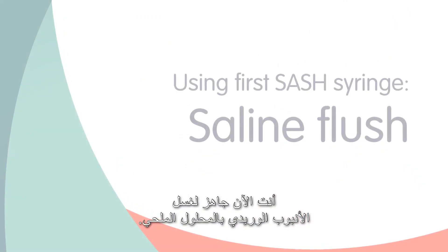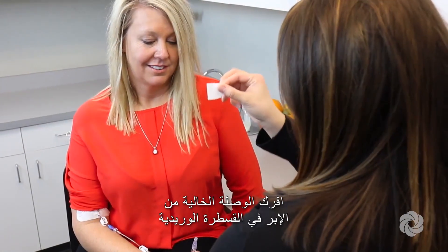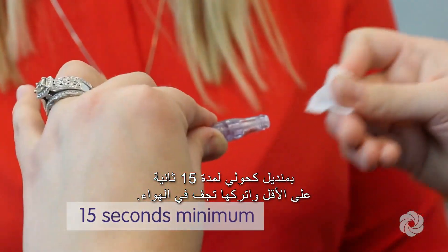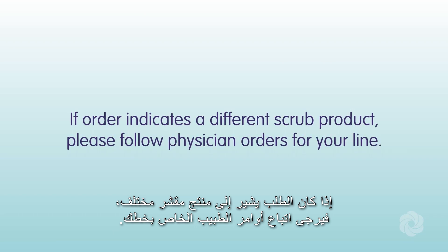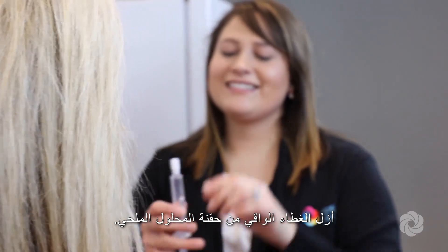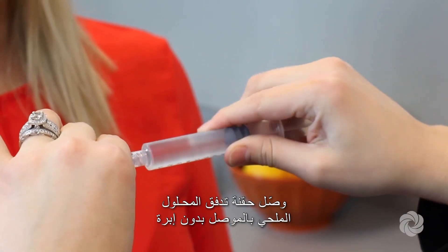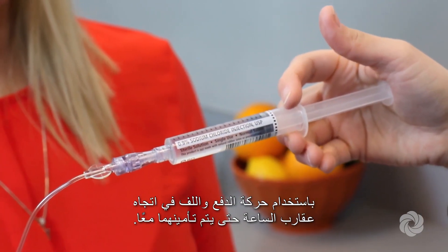You are now ready to flush your IV line with saline. Scrub the needleless connector on your IV catheter with an alcohol wipe for at least 15 seconds and allow to air dry. If your order indicates a different scrub product, follow physician orders for your line. Once cleaned, do not allow the needleless connector to touch anything. Remove the protective cap from the saline flush syringe and attach it to the needleless connector using a push and clockwise twisting motion until secured.